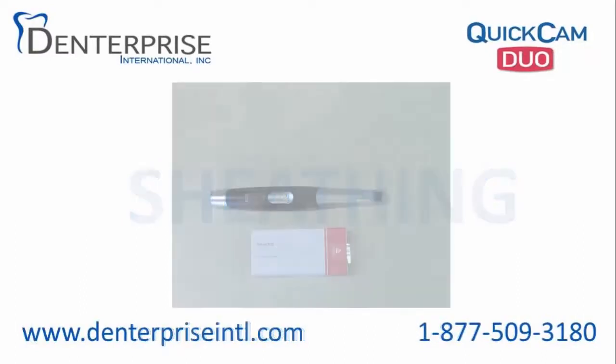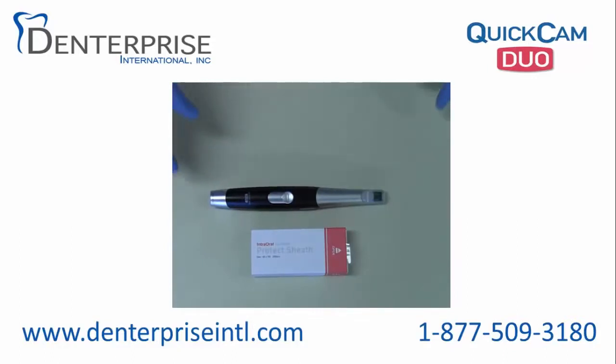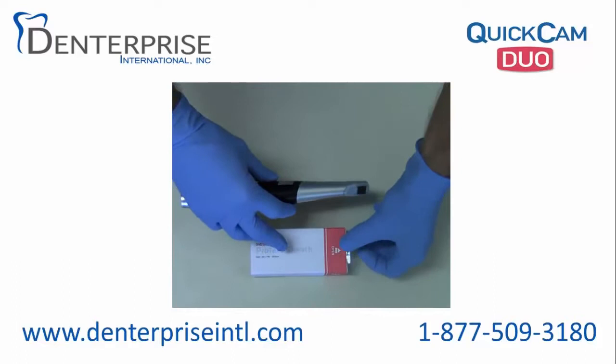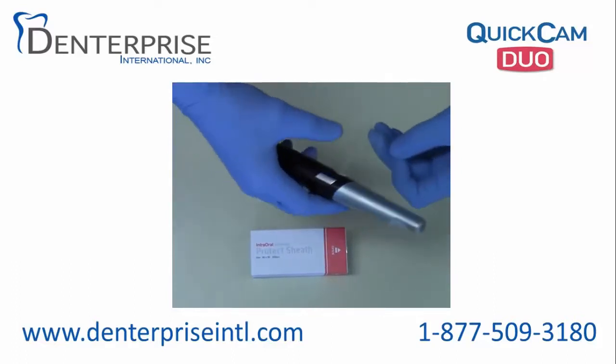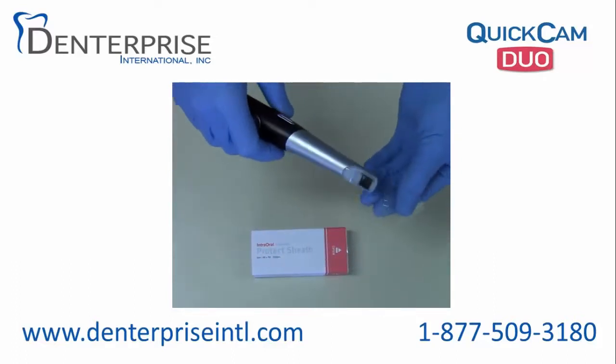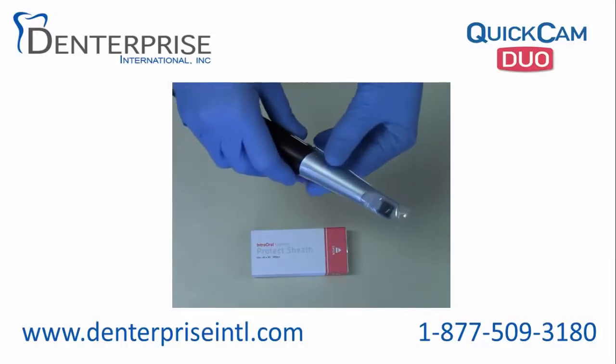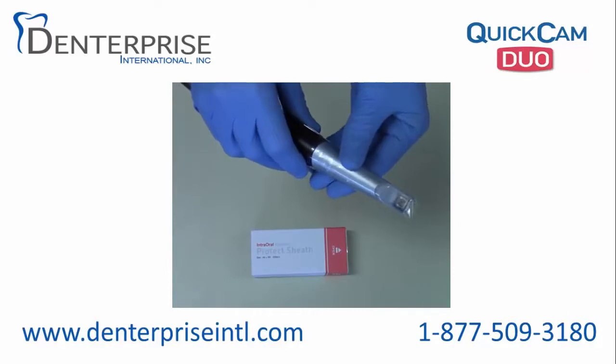First, sheathing the camera for sanitary purposes. There are some specially sized sheaths included with each QuickCam Duo. They need to be installed for each patient tight without wrinkles in order to maintain optical clarity.